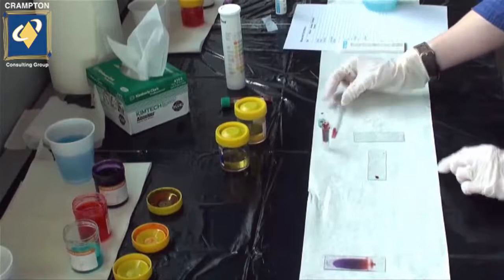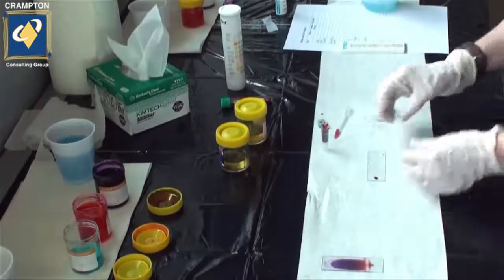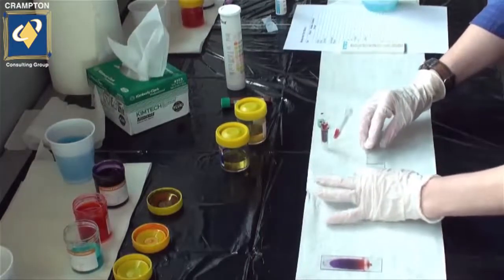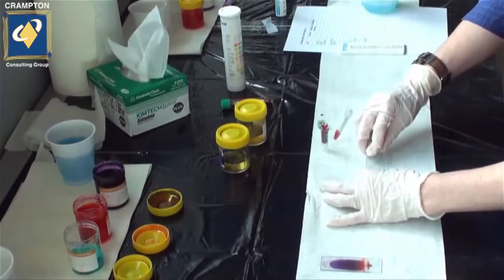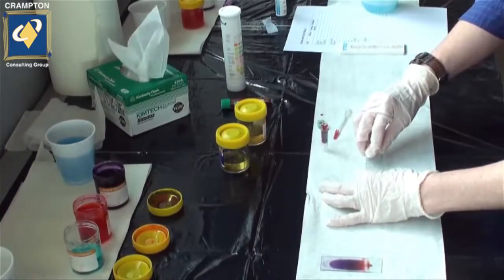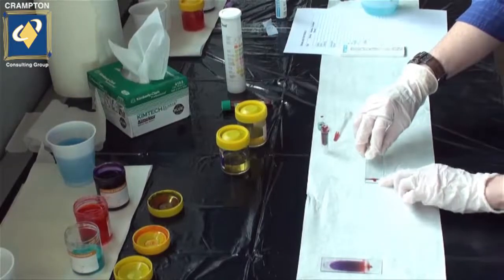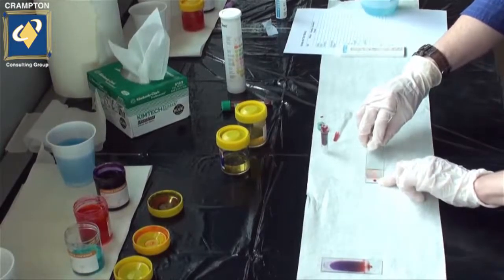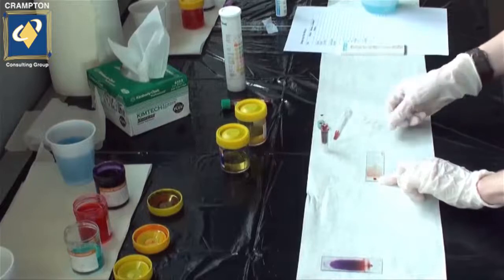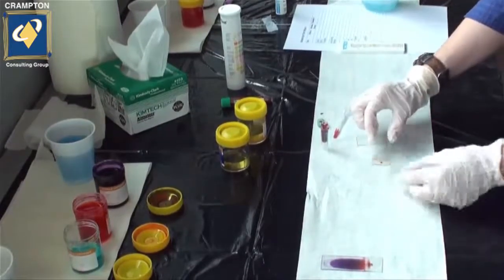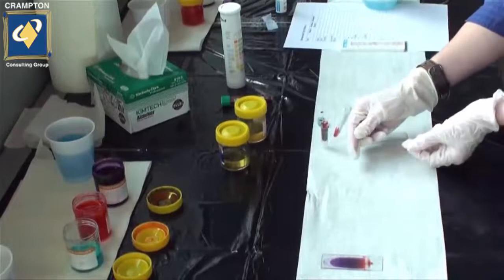We then use the spreader at a 45 degree angle to the drop of blood. We push the spreader up to the spot, allow a line to develop across the spreader, and then in a smooth motion, pull the spreader away from the line to perform the actual smear.